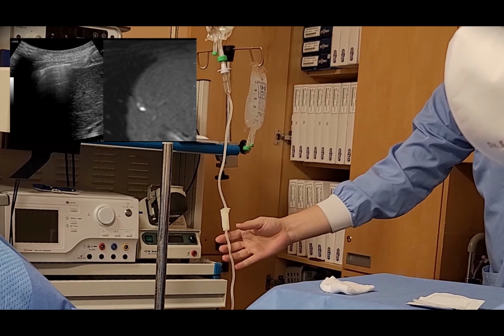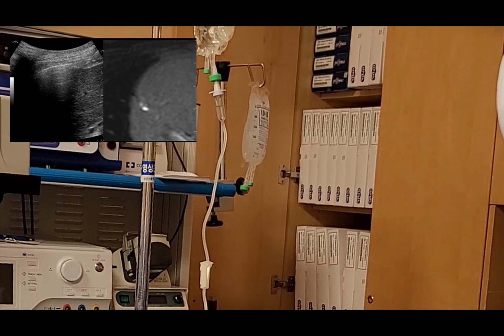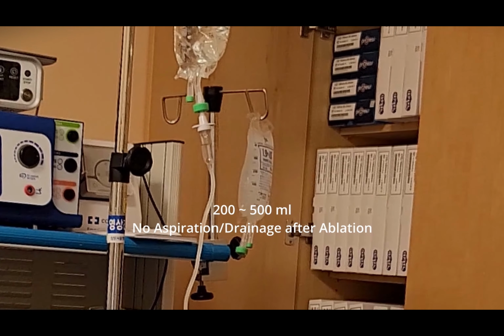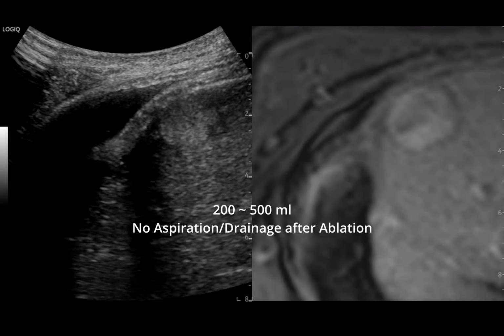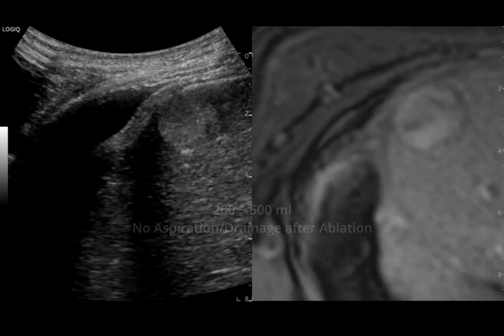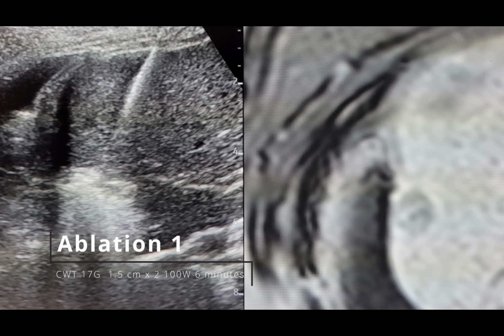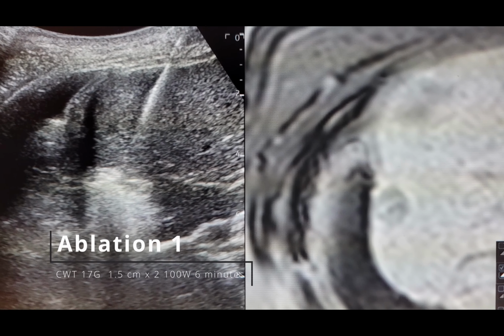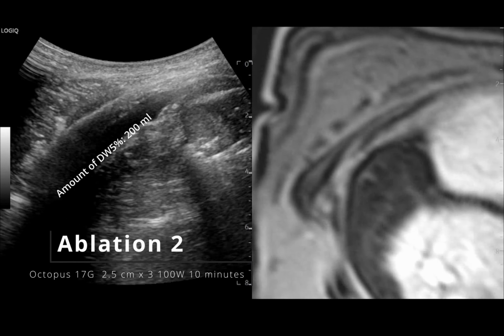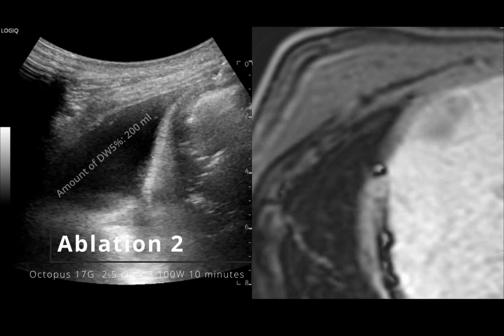That point is the pleural area. So just 1-2 minutes later, you can see we can move the pleural lung parenchyma upward. 500 milliliters is enough. Okay, you can see the artificial pleural effusion. The lesion is more conspicuous, and we can protect the diaphragm as well. Okay, first ablation using multiple radiofrequency ablation, and then move to the superficial area and ablate again. We don't drain out the pleural effusion.